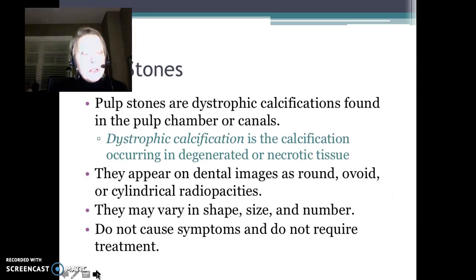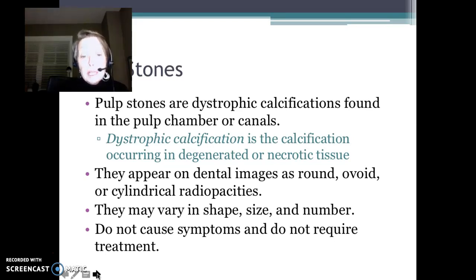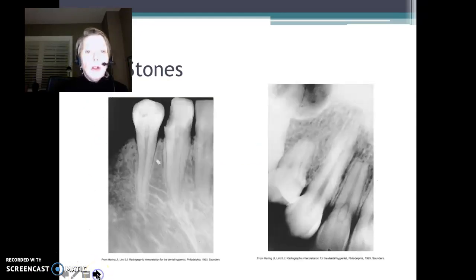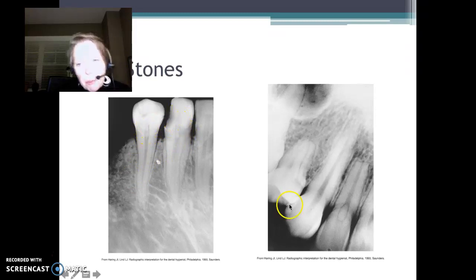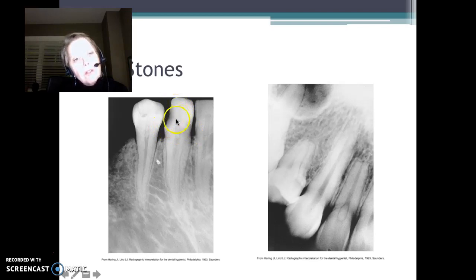Pulp stones are calcifications found in the pulp canals. They're dystrophic calcifications — calcification of necrotic tissue, of dead or dying, degenerating tissue. Pulp stones don't require treatment and cause no symptoms. We're looking at teeth 27 and 28 here. Do you see these oval calcifications in the pulp chamber? Those are pulp stones, related to trauma — in this case, the trauma of decay, probably long-term decay.